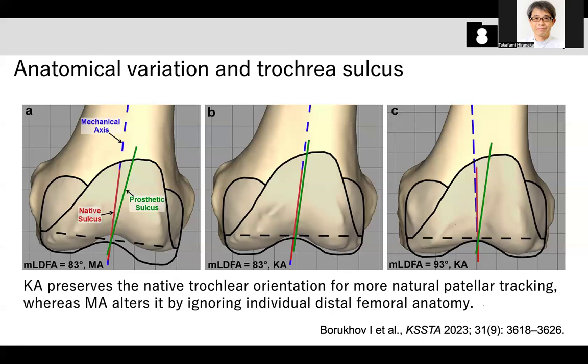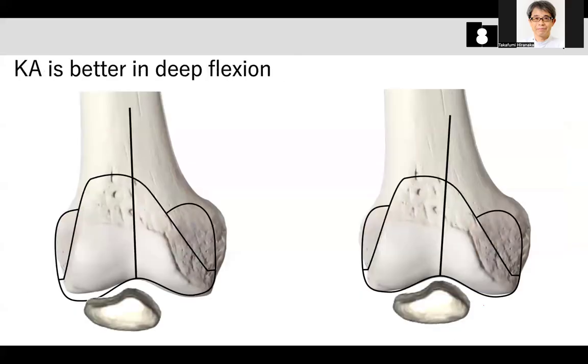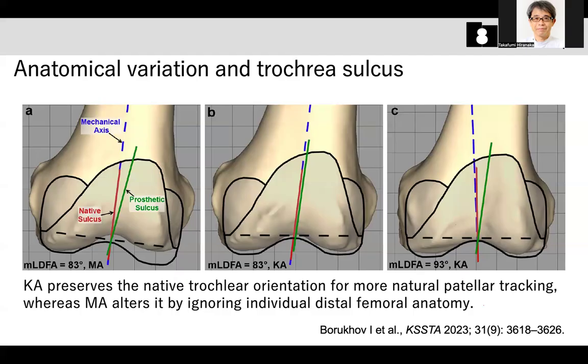If we ignore the distal femoral line, a mismatch of the groove and the component groove can occur. ちょっと話難しい。MA っていうのは、要するに、ジョイントラインを無視するわけですよ。で、軸ばっかり考えるから、この角度にあってグルーブが形成されている。それを無視するから、かえって、食い違いが大きくなるん違う。それに対して、これのジョイントラインに合わせて設置することで、結局グルーブも合ってくると。というふうな考えを言うたはずですよね、この人はね。はい。っていうことになります。So, but this is the story in the early flexion, early to mid flexion.